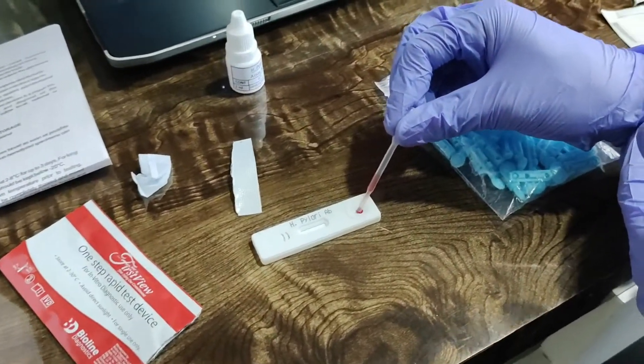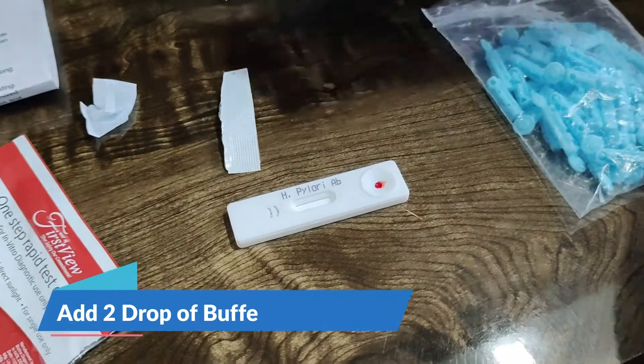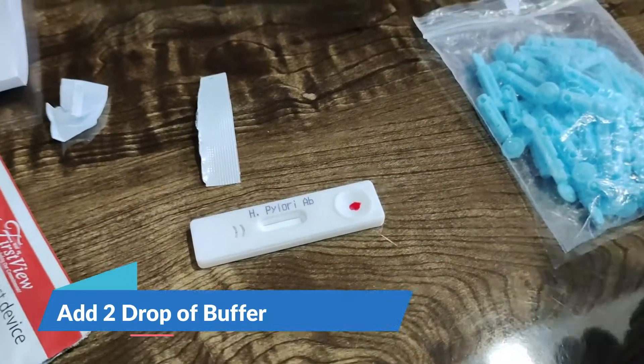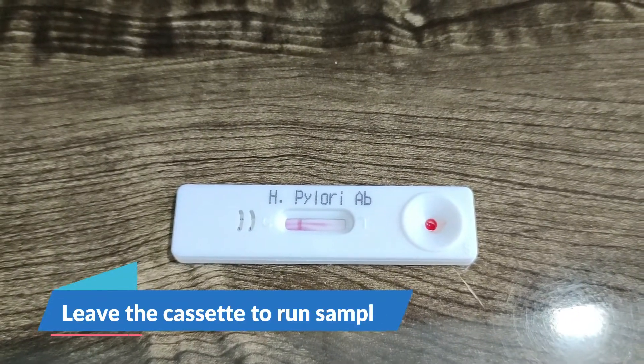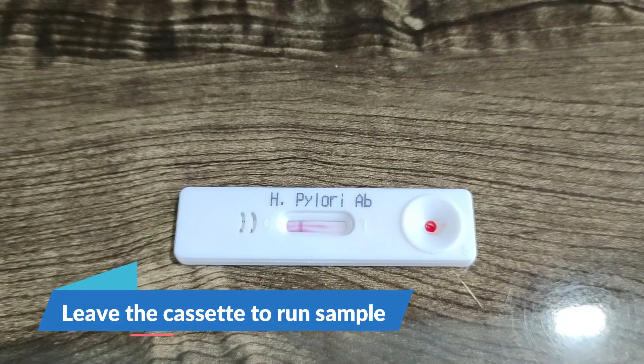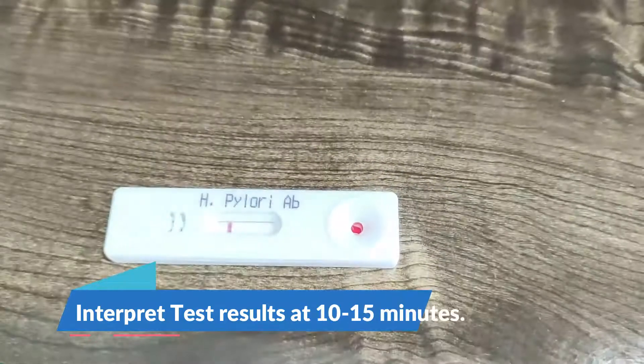We will drop the sample in the sample well and we will put two drops of buffer, and it started to appear. Now it will take 10 to 15 minutes to get a clear band.